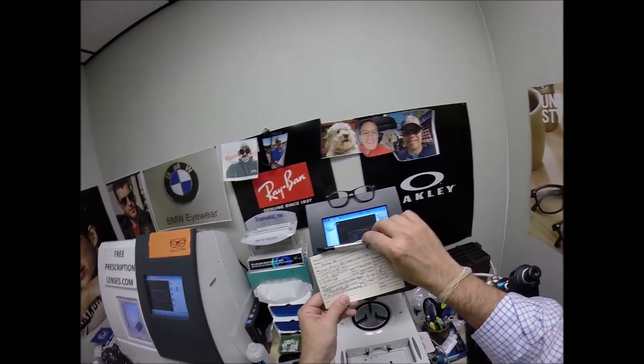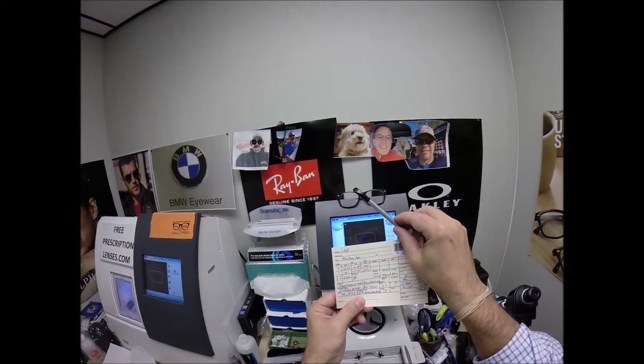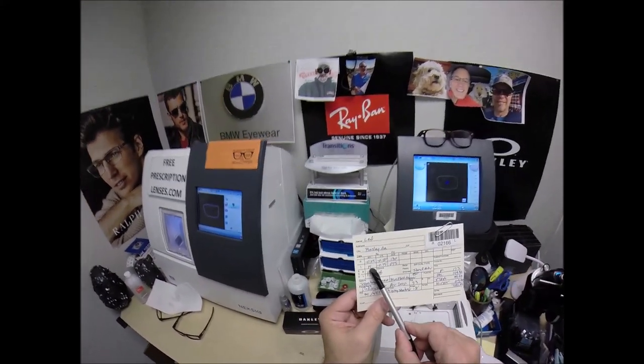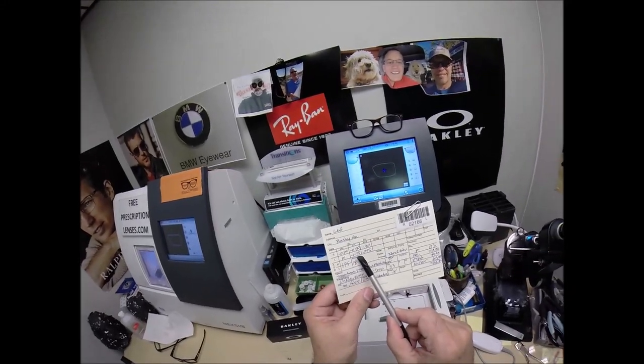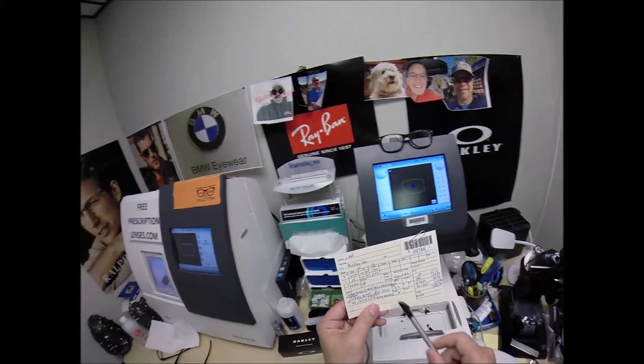We're going to turn to 130 for the right eye. The axis for the left eye is 75. So you need no power correction to see distance out of your left eye, but you have three steps of astigmatism correction.